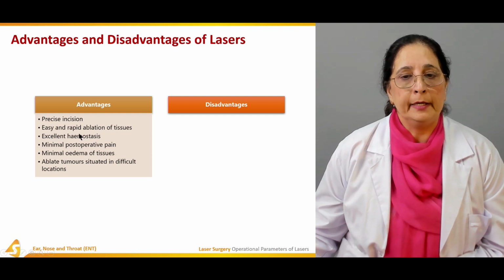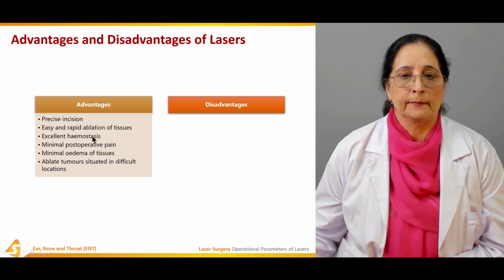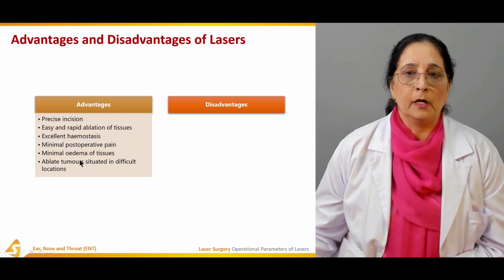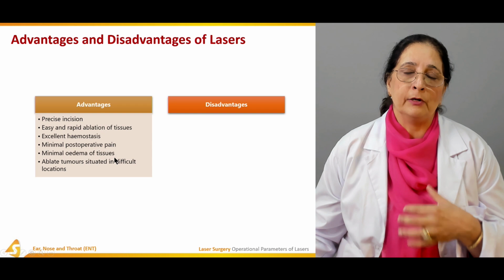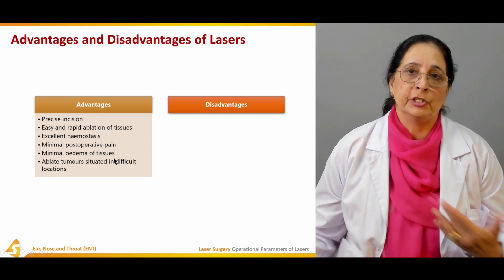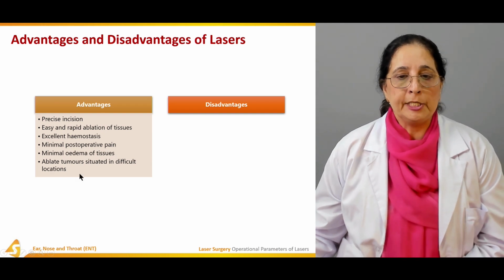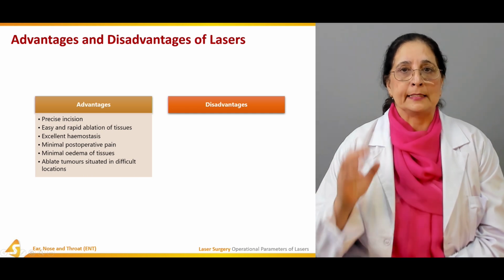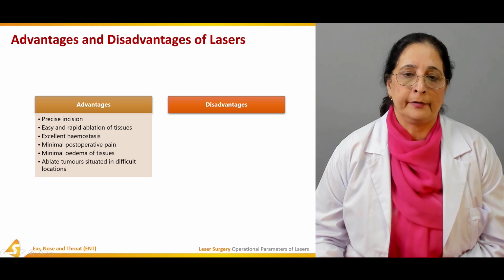Easy and rapid ablation of tissues, excellent hemostasis, minimum post-operative pain, minimum edema of the tissues, less handling of the tissue, and less manipulation. It can ablate tumors situated in difficult locations because we can easily access different areas.